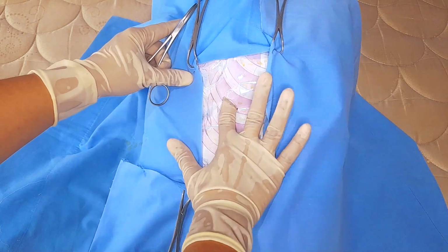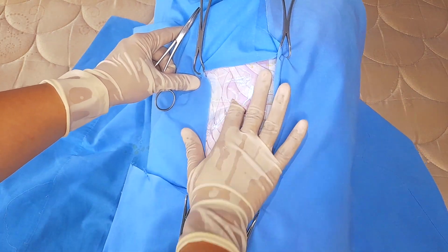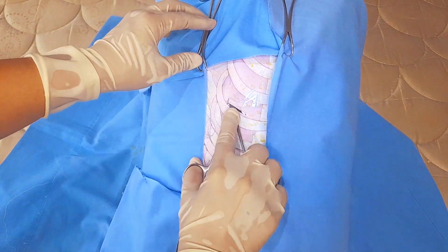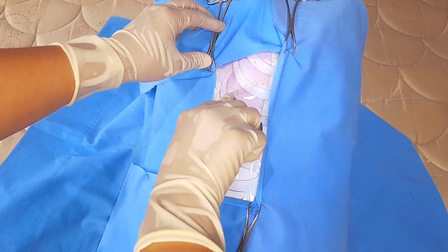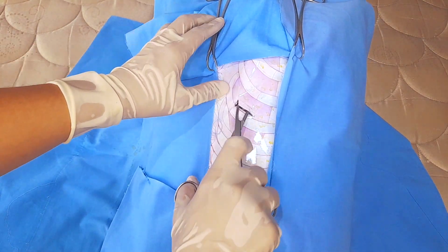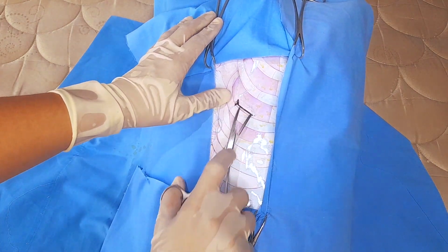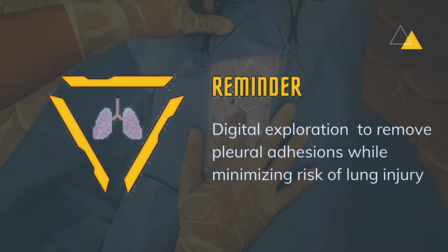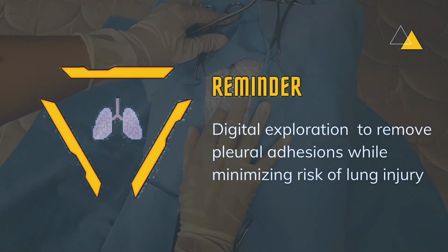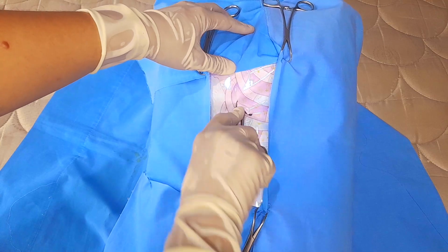Further enlarge the opening of the pleura with a large Kelly forceps. Reminder: perform digital exploration to remove pleural adhesions while minimizing risk of lung injury.